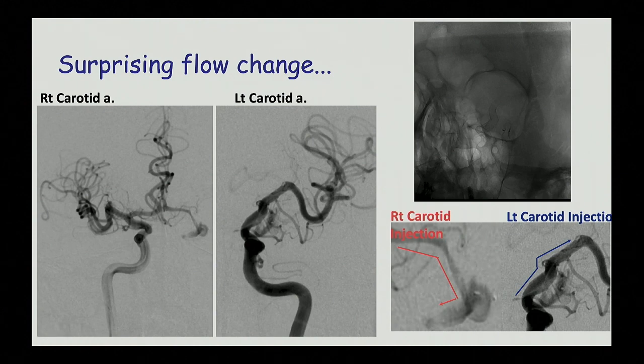The patient was doing well. The posterior cerebral artery is open, and there is minimal filling of the aneurysm, almost nothing, because you see we have already the web here, a very small filling of the sac, and this is the posterior communicating.